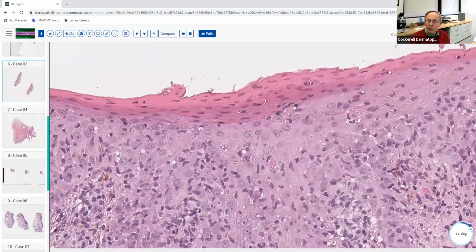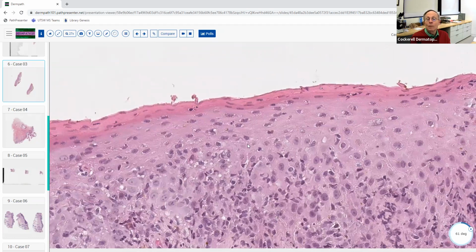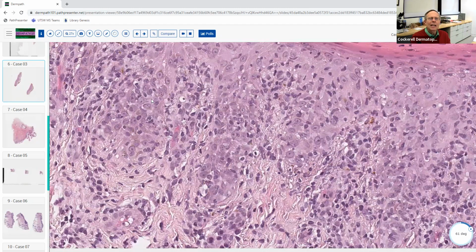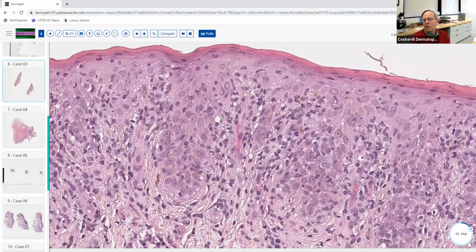You commonly get parakeratosis because the lesions are often kind of scaly. You can remember you get the little collarettes of epithelium around the lesions on the palms and soles, those ham-colored papules and whatnot. You may get neutrophils in the cornified layer. We don't see a lot of it here. There's maybe a couple, but it's mainly just parakeratosis. Sometimes you can get some dyskeratotic keratinocytes with syphilis. I don't really see a lot of that here, but I've seen this simulate pityriasis lichenoides also.